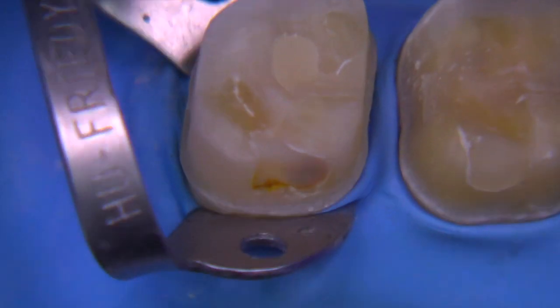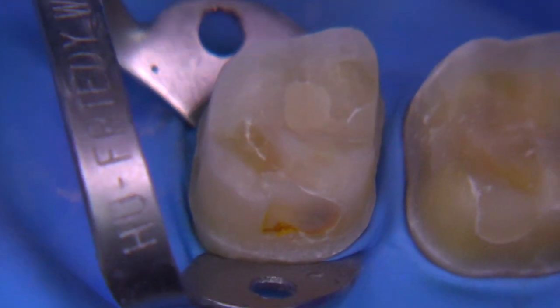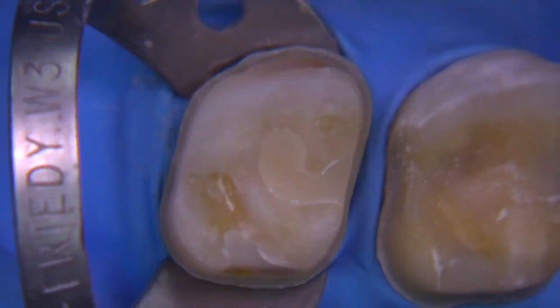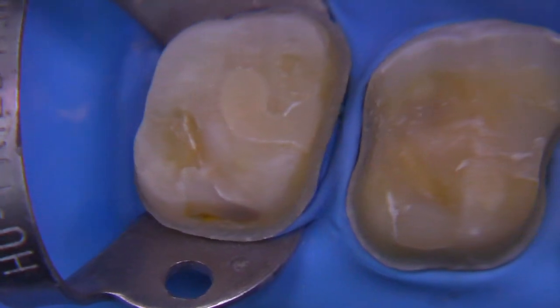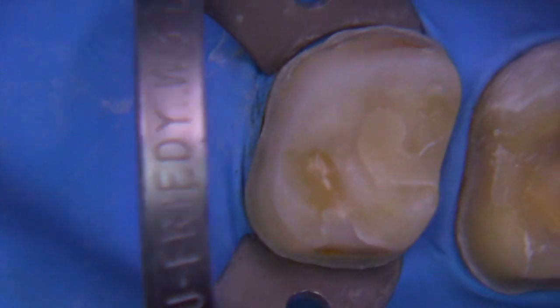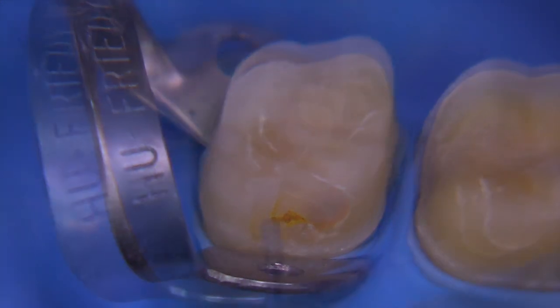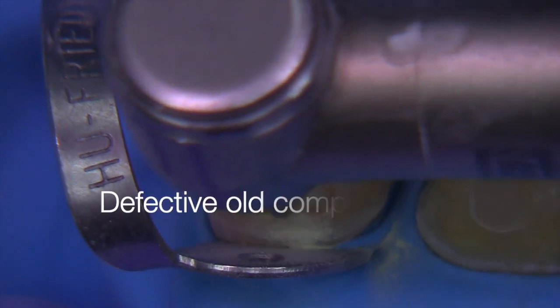So the preparation is coming along. We have some refinement to do, but the main issue right now is look at the caries underneath that composite. I like to sometimes just leave the old restoration in place, prep the tooth, and then decide what I need to do. It's not always necessary to disassemble everything if the composites underneath are in good condition. Some of the composites are good and some are not, so we're going to remove the ones that are questionable.